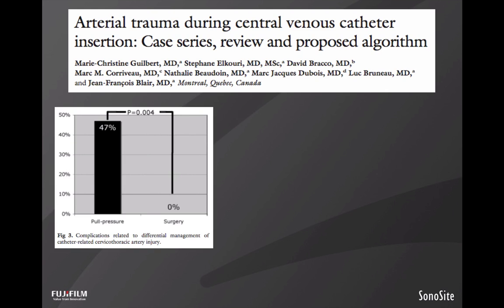And some of these complications were not subtle. These were large bleeds. I think somebody lost their airway. These are not great complications, something you would not want in your patient. And I do this lecture all around the country. I've seen this numerous times, and people raise their hands. I've had embolic events from a huge hematoma I caused, et cetera, et cetera. So they recommend if it's a 7 French or larger, you don't want to pull these, and you should get consultation.